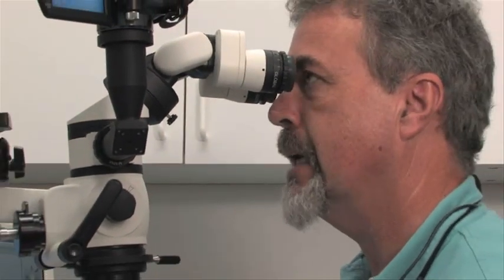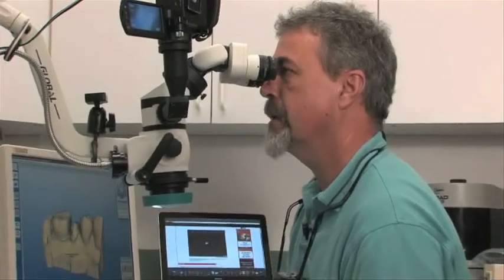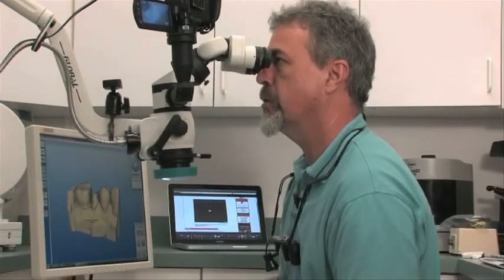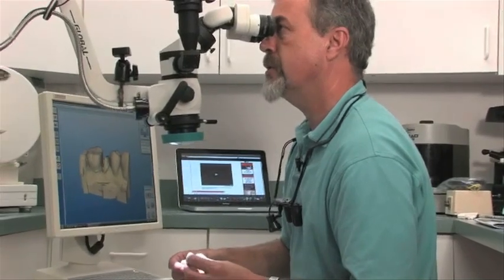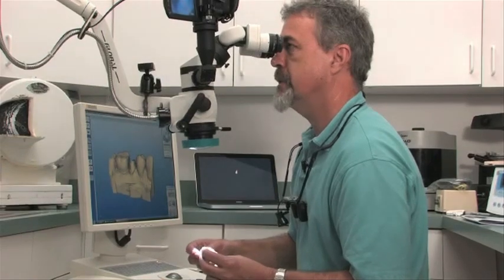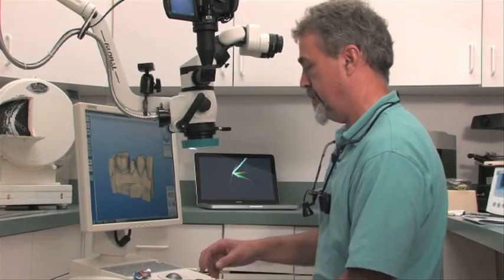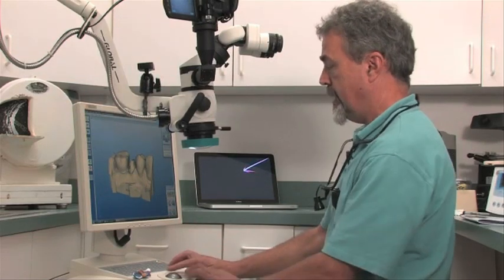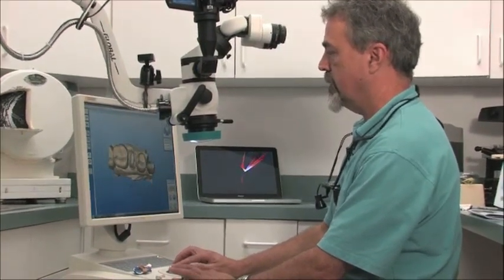Once I went back and looked under the microscope at my actual impression, I could see where those discrepancies were. Traditionally, I've always taken two crown and bridge impressions so that I would have a second view. In this case, we did two CEREC crowns on this patient, although we did not cement them. So let me show you a little bit more of how this technology works.